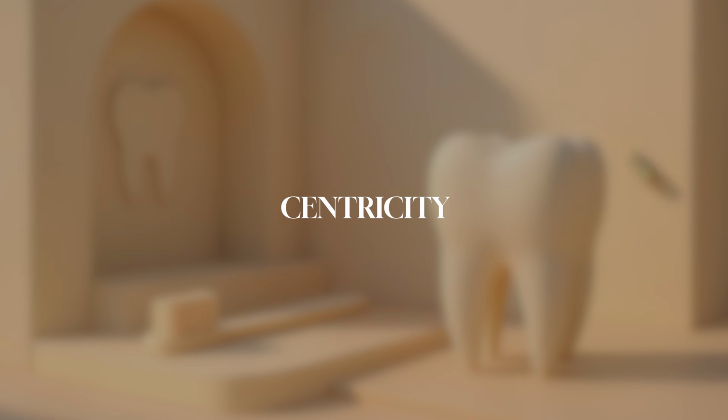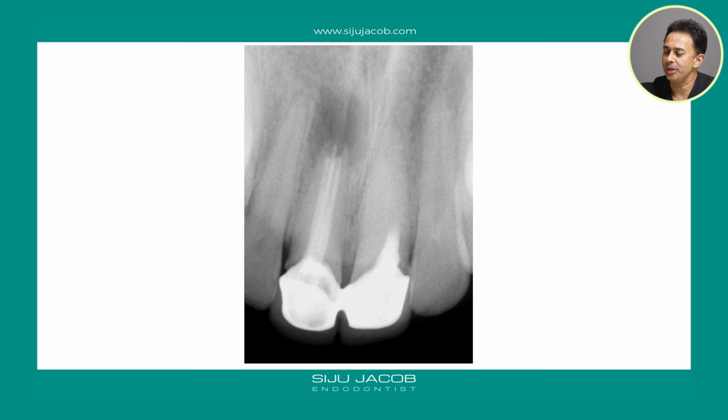The next principle we can use is something called the law of centricity. What is the law of centricity? The structure of roots and the canals are in proportion, which means when you take a radiograph and you see that someone's made an access cavity and filled a part of what looks like a canal, but that filled portion is not in proportion when you look at the tooth as a whole, we can see that it's skewed to one side. So once we see something like this, you know that it breaks what we call the law of centricity. You can use that as a clue to estimate where the calcified part of the canal is.